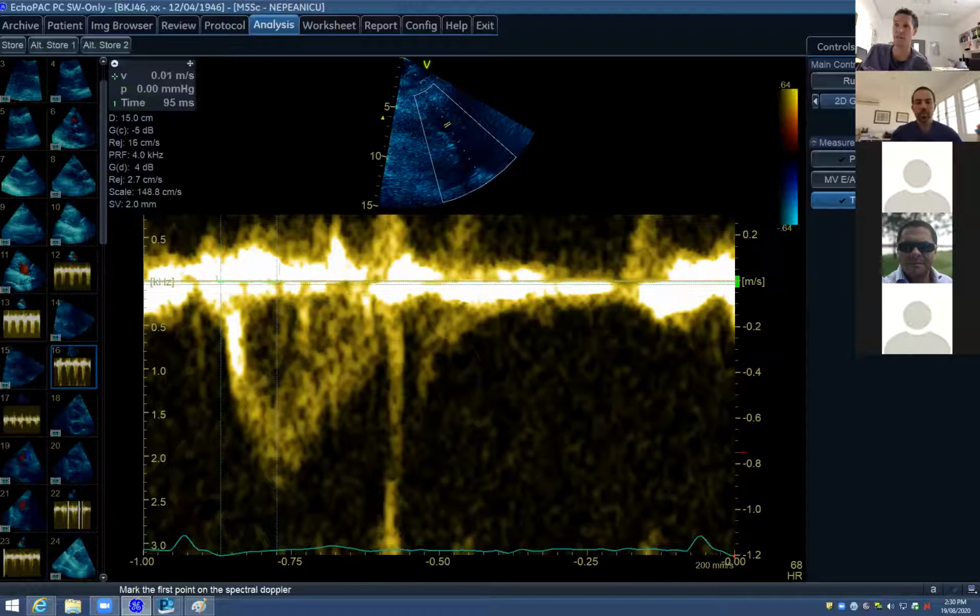This is the resistance, and I can show you the paper where I get that from in a sec, if I remember. So I use 90 as the cutoff. If we're sitting at 95, exactly as you said, and I move this little probe back just a tiny bit, I'd probably get a marker giving me 110 milliseconds versus 90. Very small movements make a fairly big difference. So using the value of 90 is the one that's been most commonly linked with raised pulmonary vascular resistance.